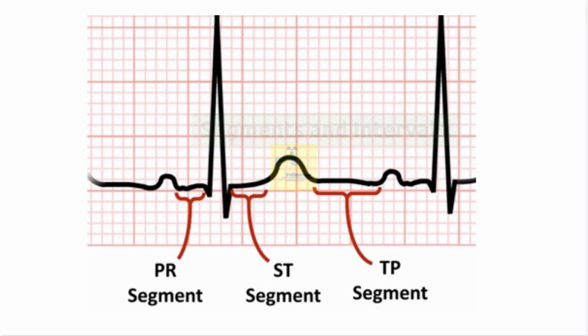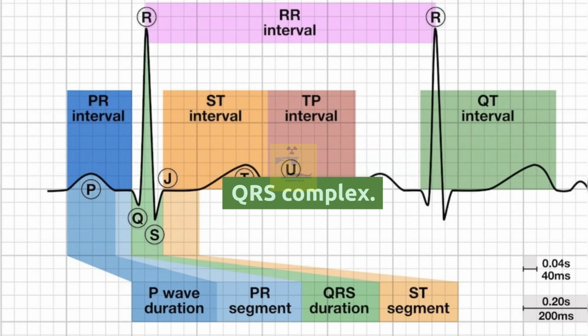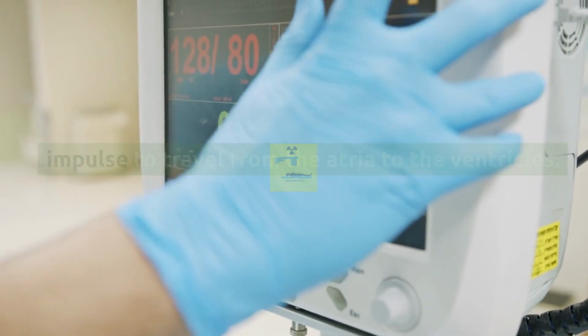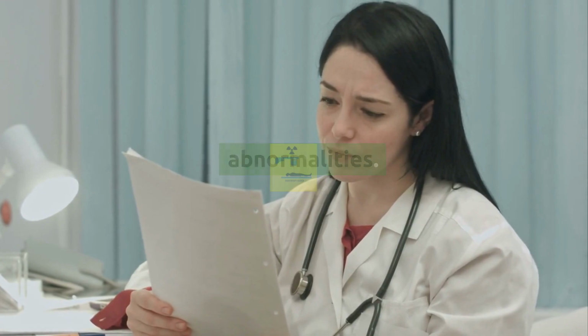Segments and intervals. PR interval. This interval measures the time from the beginning of the P wave to the start of the QRS complex. It represents the time it takes for the electrical impulse to travel from the atria to the ventricles. Abnormal PR intervals can indicate conduction abnormalities.